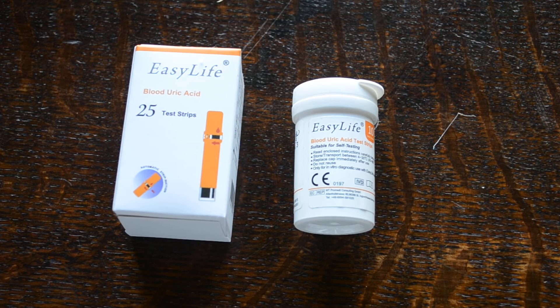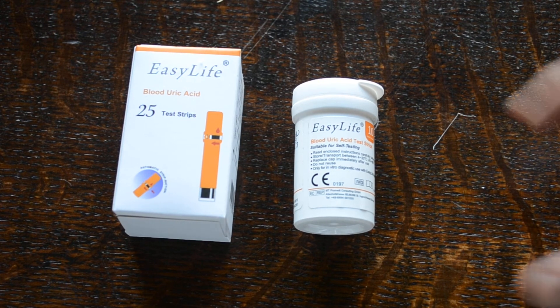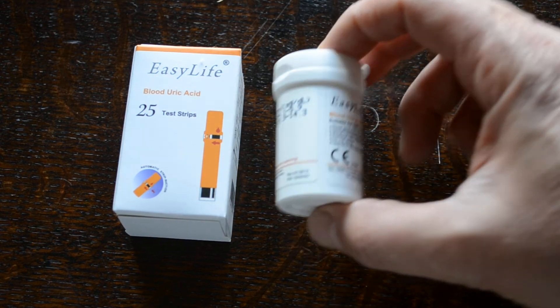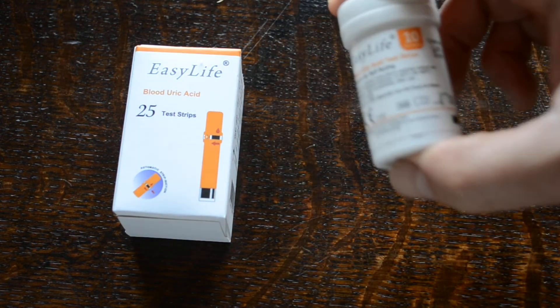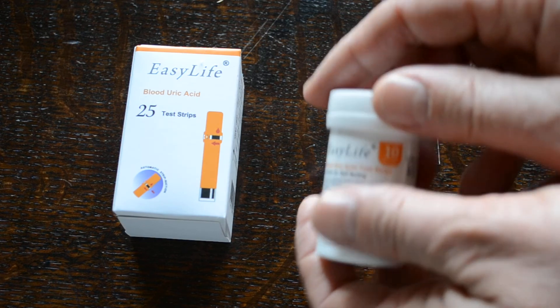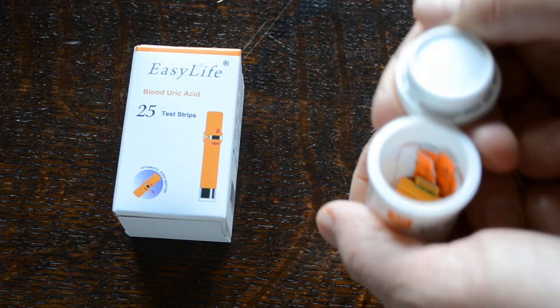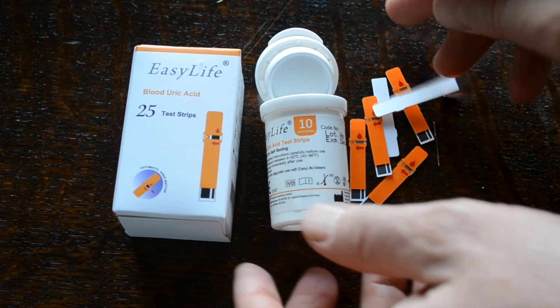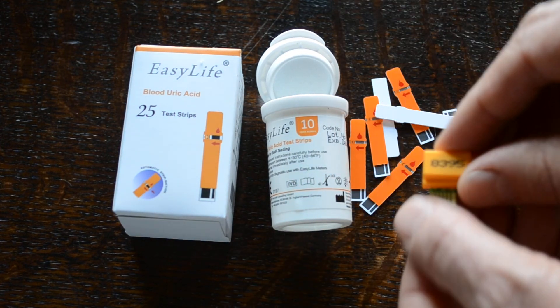When you buy a refill pack you get 25 individual test strips. When you open the pack you get a data sheet and a vial very similar to this one — this is actually a 10 strip vial, which is the pack supplied with the meters when you buy it. Inside you have your test strips and your code chip.